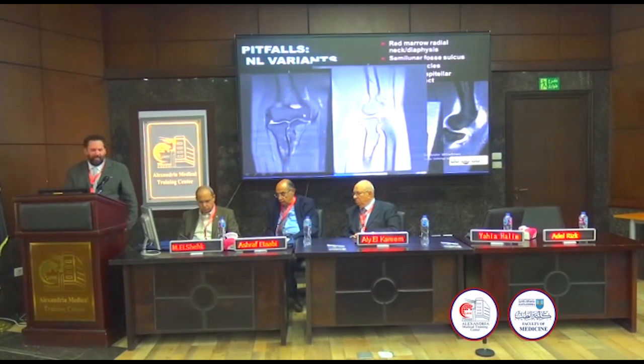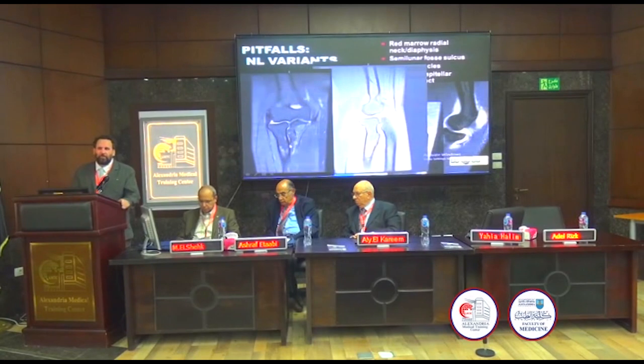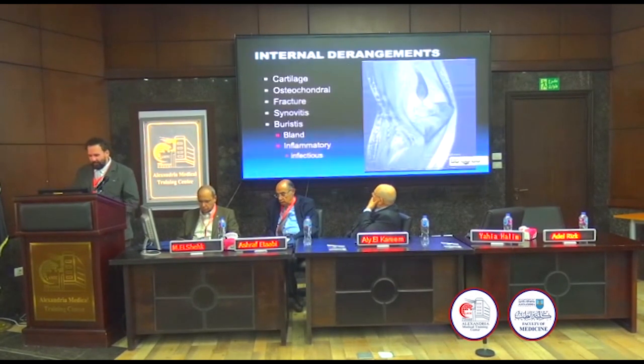And here's a case that I just saw last week. A patient came in to rule out an occult fracture, and we see this edema in the proximal radius, and that's just normal red marrow. That's not a fracture.